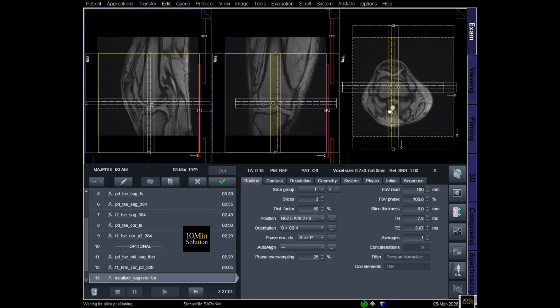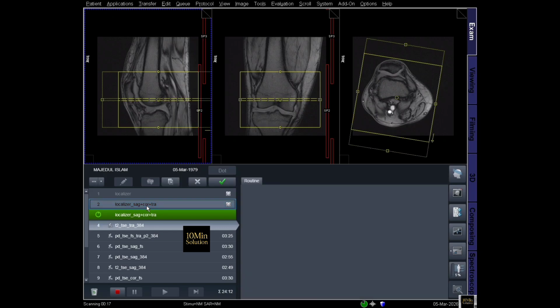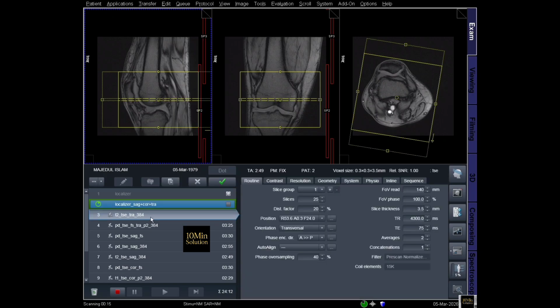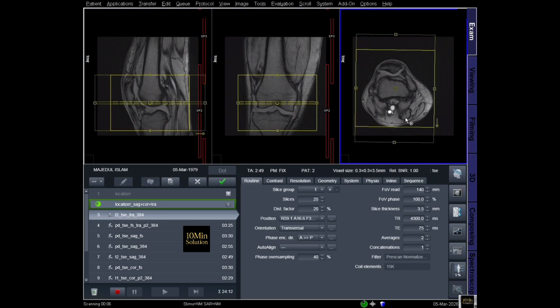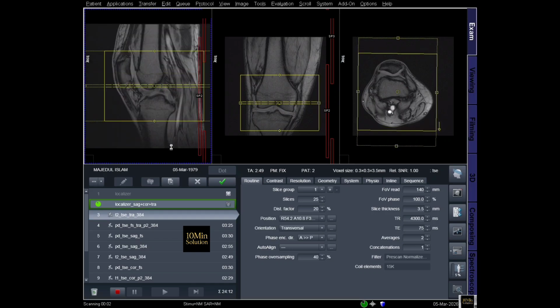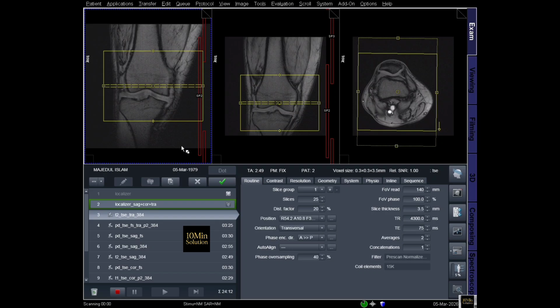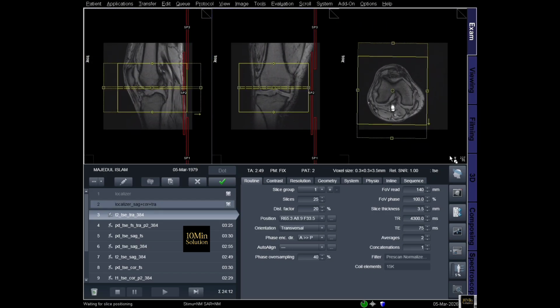effusion. Patient positioning. For MRI of the right knee joint, the patient is positioned in the supine position on the MRI table. The right knee is placed in a dedicated knee coil to obtain high-resolution images. The knee is kept in a neutral or slightly flexed position, usually around 10 to 15 degrees, to reduce ligament tension and improve anatomical visualization. Immobilization pads may be used to minimize motion artifacts.